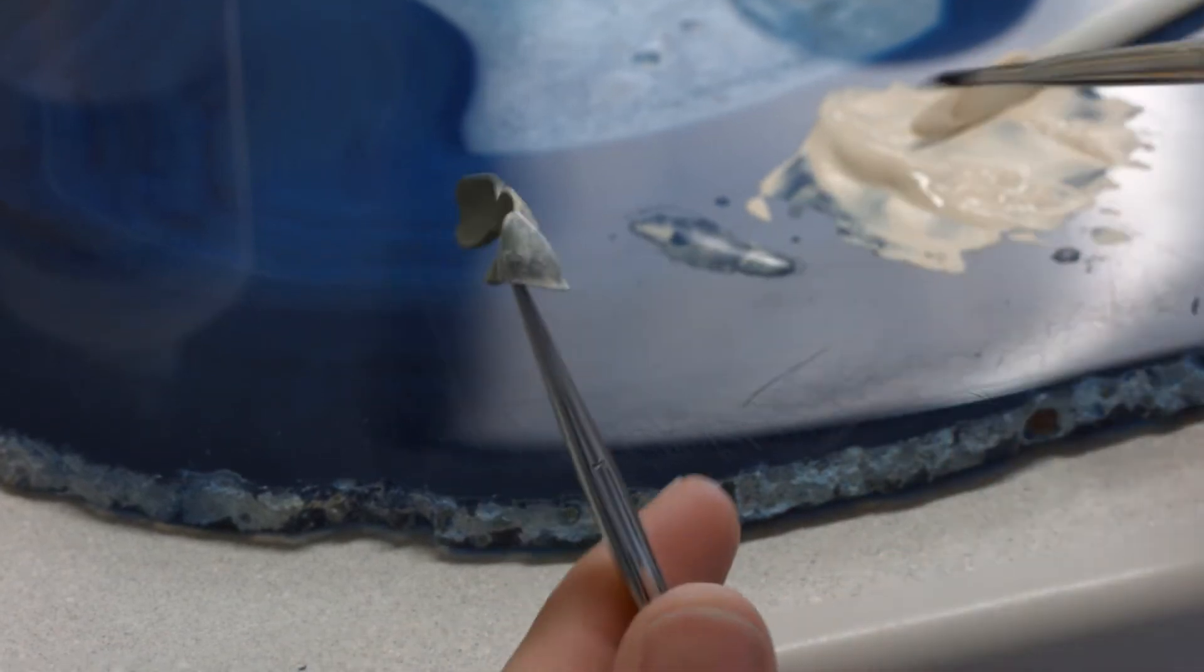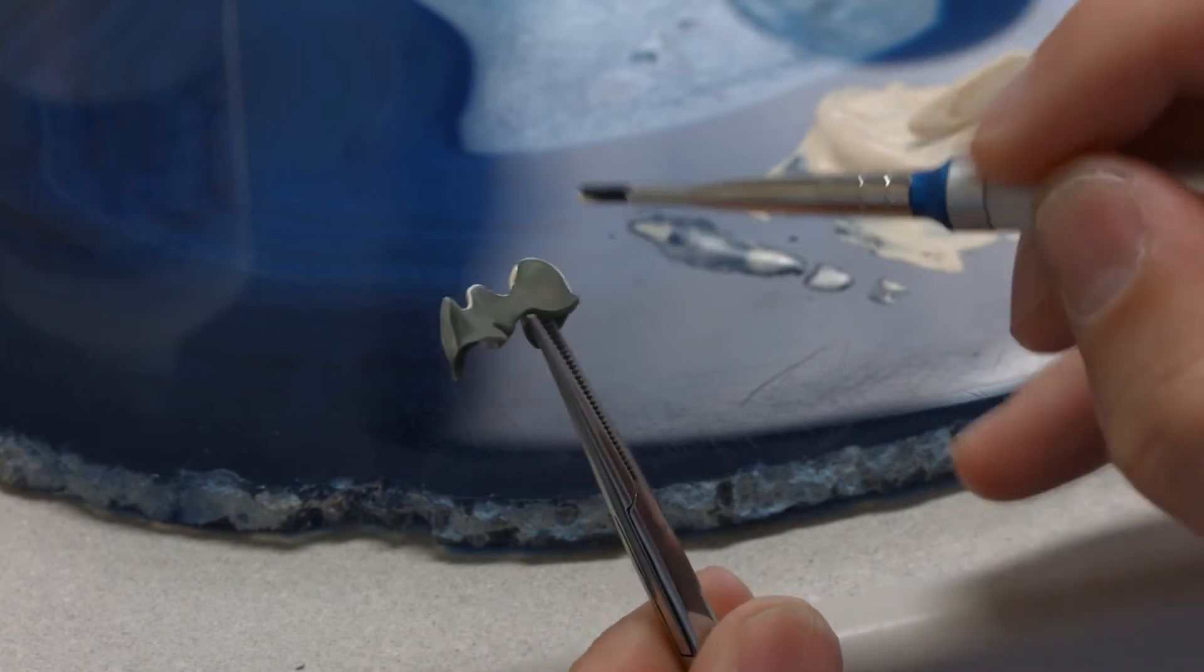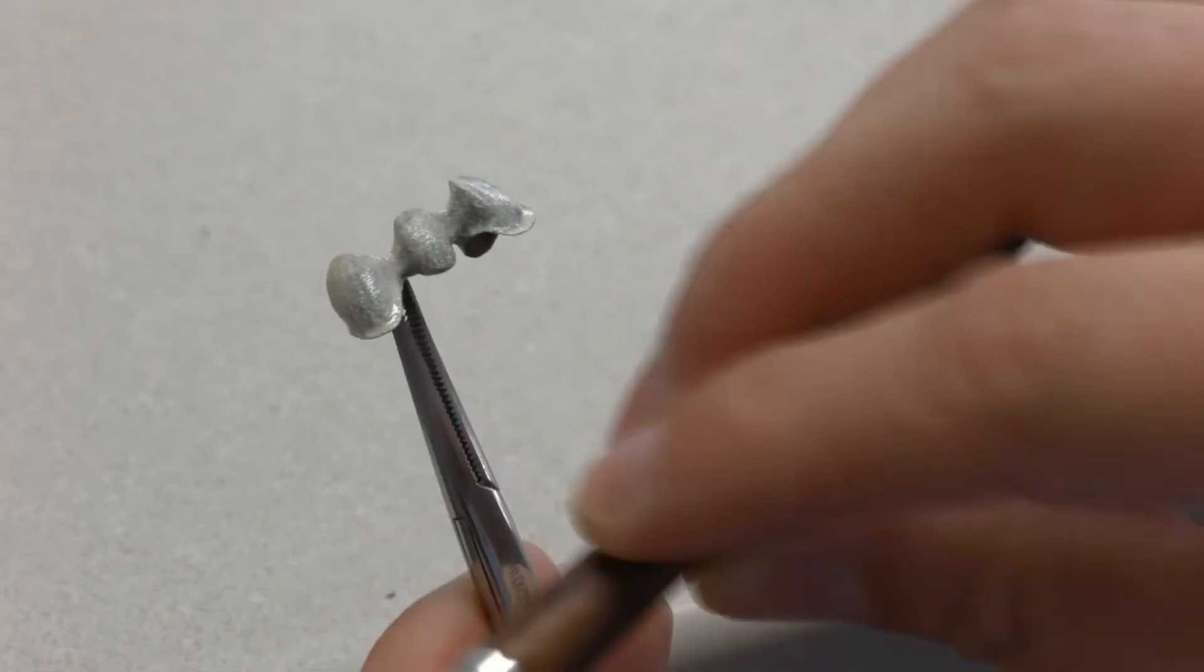Completely coating the metal with the opaquer or wash creates a sound bond between the metal and all the subsequent ceramic layers.